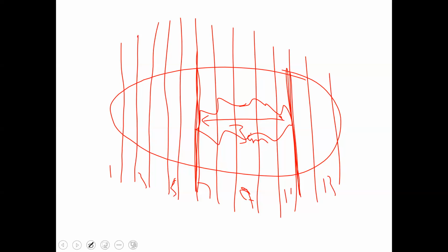Another important feature is to get the flanking sections. By flanks I mean at the edges. For example, if this is a flank and this is a flank, it's important to put these in and show that indeed there was no cancer in, let's say this is medial and this is lateral, the medial flanks and the lateral flanks. Again, that helps me assess that our gross indeed matches with the microscopic assessment.